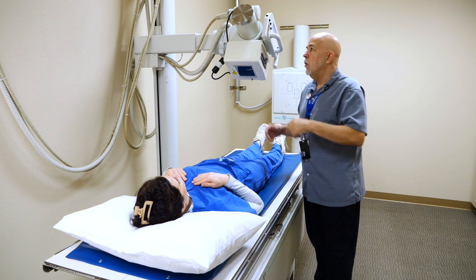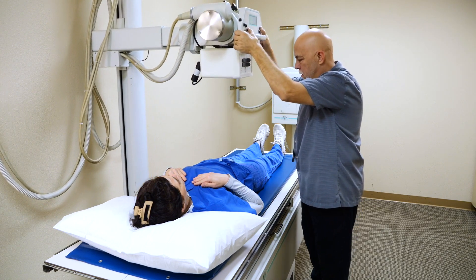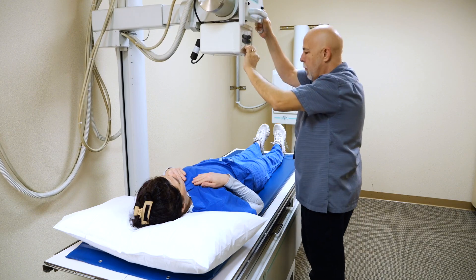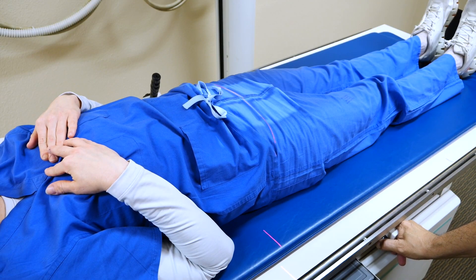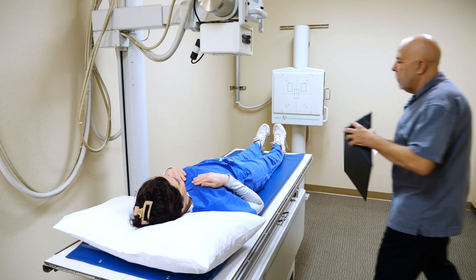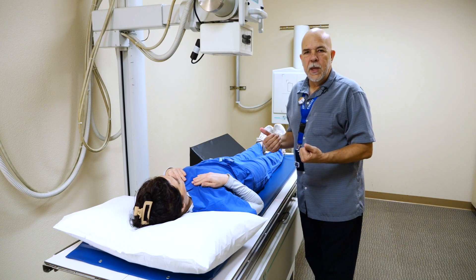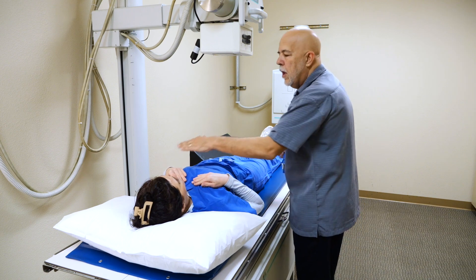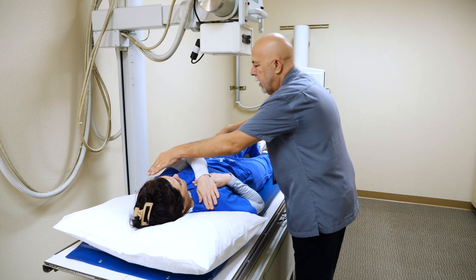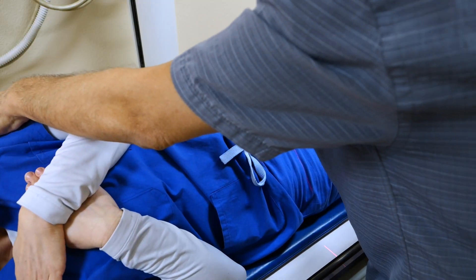For the obliques, there's two ways to do it. We're going to cover the standard obliques first. We're going to get back up to our 40 inches. Make sure and line up your IR first. For the oblique, I'm going to grab a sponge here. We're going to do the left side first, so we're going to roll her towards me 25 to 30 degrees. Place this hand on this shoulder, bend this knee up — kind of like you're doing obliques for an L-spine, just roll like a log towards me. And I'm going to put this 30-degree sponge behind her back and then roll back.